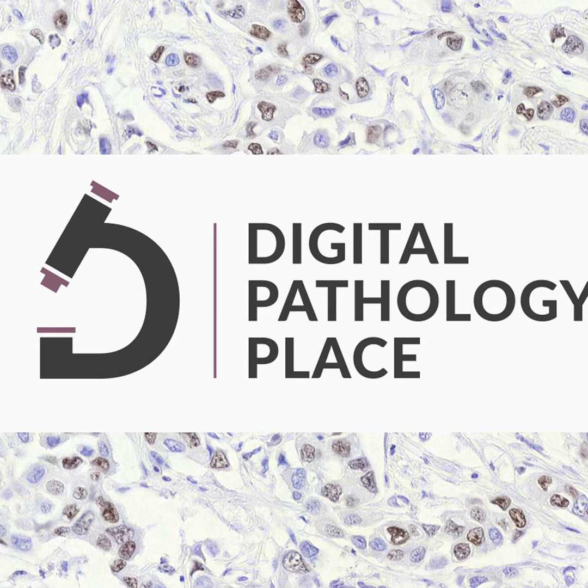So DICOM for images, it's not just the format in which the pixels are encoded. It's also a bunch of metadata associated with the image, right? Absolutely. And that's the key distinguishing characteristic of DICOM as opposed to, for example, TIFF, which is intended to encode the pixels and describe the pixels. And it is extensible in the sense you could add tags to the TIFF header that said other things like who the patient was, but that's not what people have done with TIFF, and it's not what the whole slide imaging vendors do when they use TIFF in their proprietary formats like SVS.